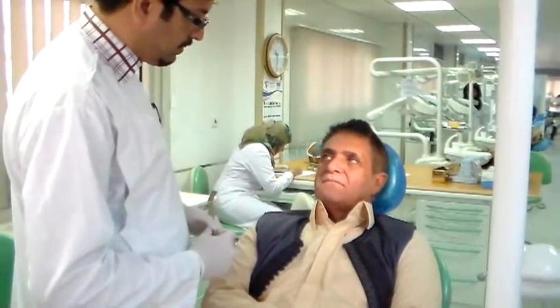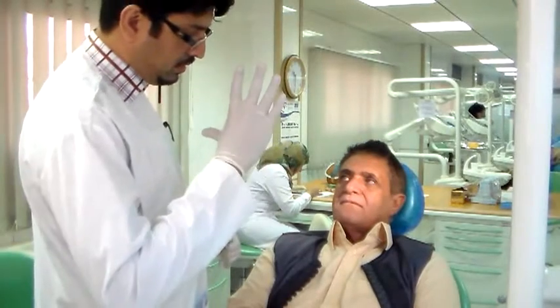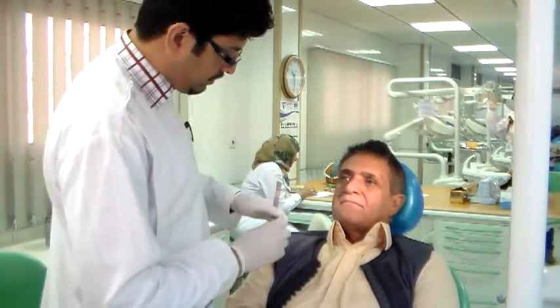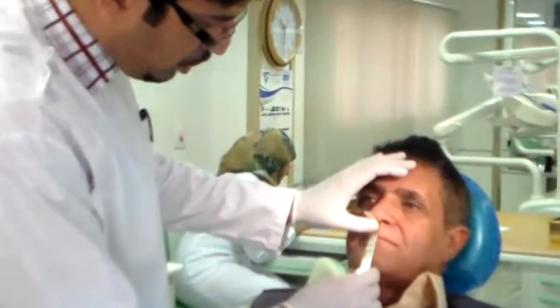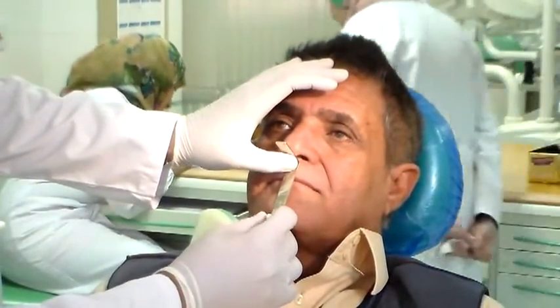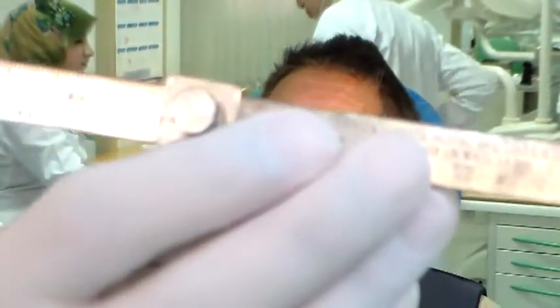Say M. Touch the lips and stop. When I put my hand like this, you say M, touch and stop. Don't open. M. So you want to do this a couple of times, and you want to measure. You don't want to put pressure on your nose. You just want to hold it there gently and close it. Then take your reading and check.